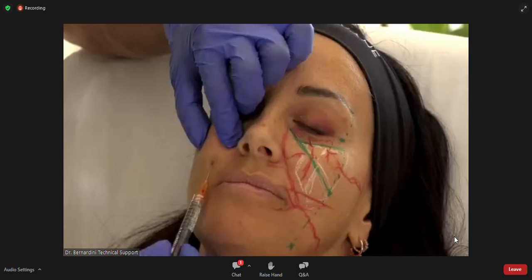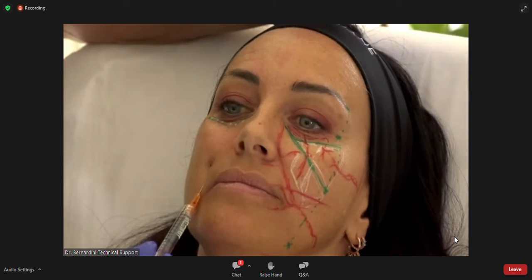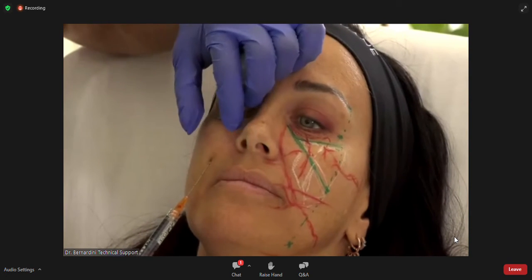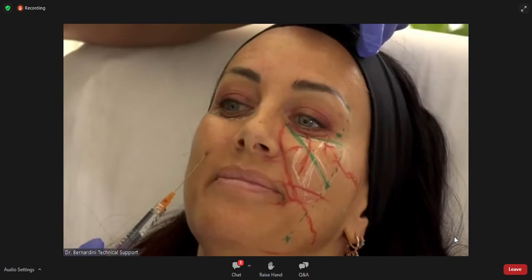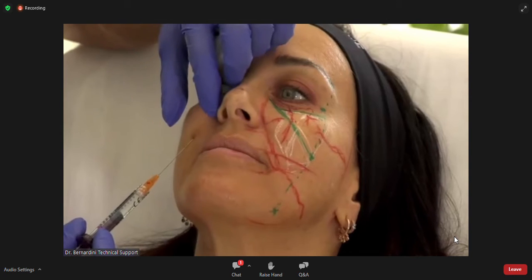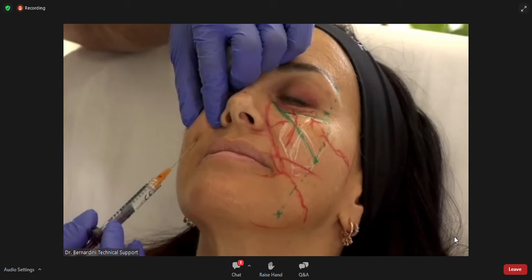Okay, so sorry. I do about 10 of this procedure a week, so this is very unusual for me to happen. I'm never concerned with the passing out of a patient, female patient model ever, but I will be more.